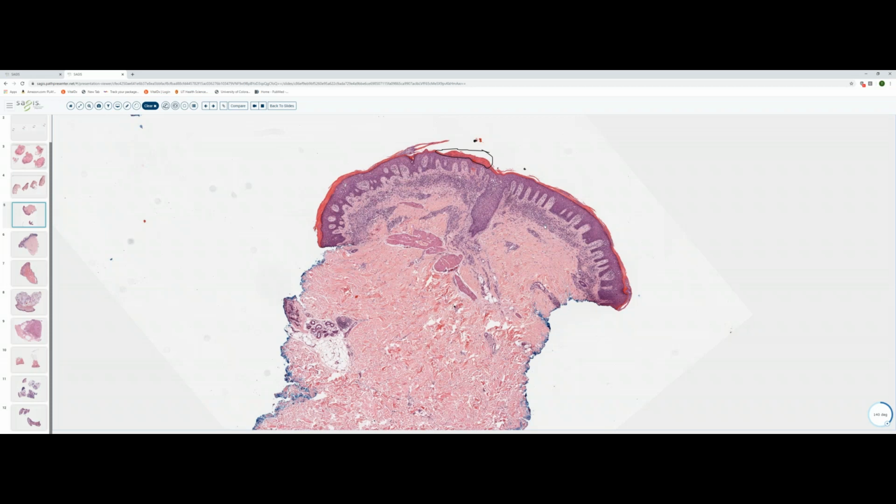Of course, with secondary syphilis, you'd like to see a little bit of a deeper infiltrate, maybe some pallor in the epidermis, and if you're lucky, as you are in 2/3 of the cases, plasma cells. With lichen striatus, you like to see kind of a heavy infiltrate around the eccrine coils. So the infiltrate will tend to track down around the eccrine coils.